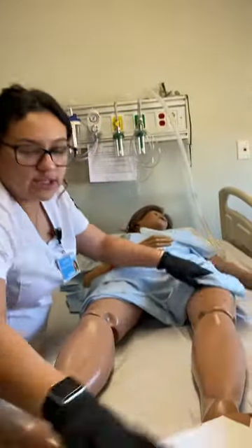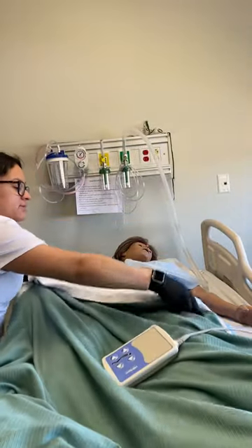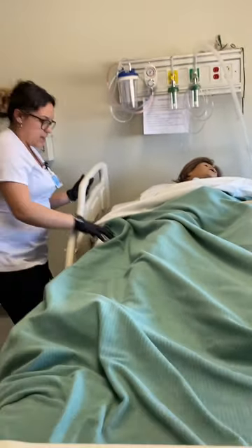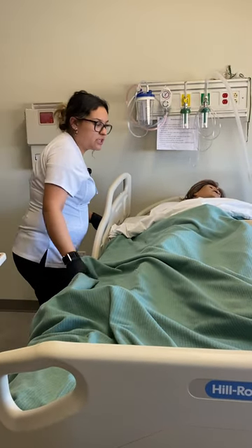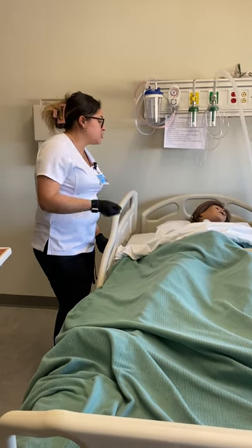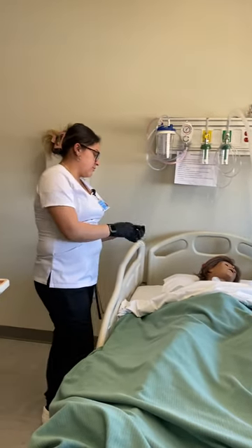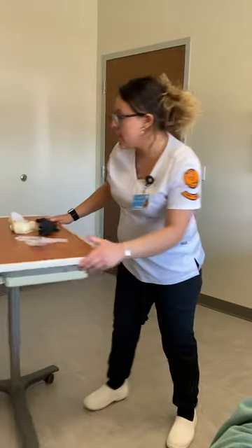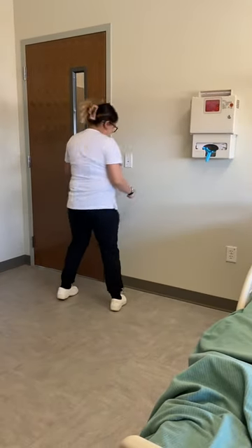Alrighty, Mrs. Smith, you can go ahead and relax your legs. I'm going to get you comfortable one more time. Here's your call light. Go ahead and lay back in bed. Just a little bit of education: it may feel a little bit weird when you first go to the bathroom — that is completely normal. Just let us know if you feel any pain that is completely unbearable or notice anything different from your urine. I'm going to go ahead and dispose of all the materials I've used today, sanitize my hands, and go document it. Thank you, Mrs. Smith.